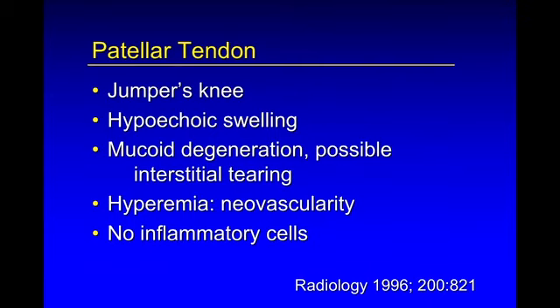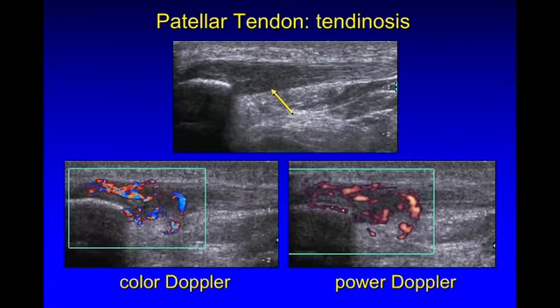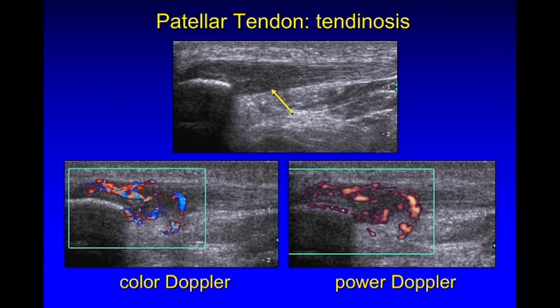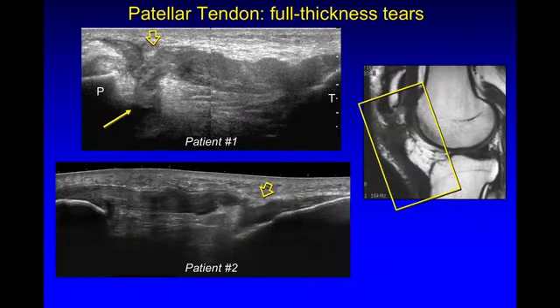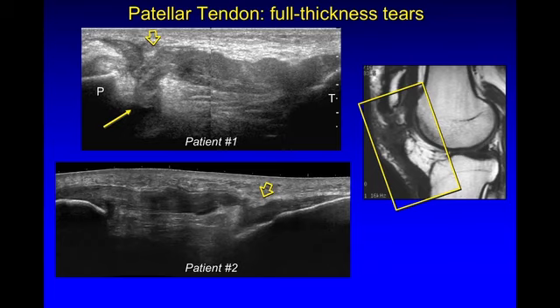Moving on to the patellar tendon, looking at what's called jumper's knee — tendinosis and possible interstitial tearing of the patellar tendon, usually proximal, typically central and deep. Neovascularity is often present, again representing hyperemia and not inflammation, and this corresponds to patient symptoms. Here's the normal patellar tendon, fibrillar and echogenic, and here we see hypoechoic thickening and hyperemia, consistent with tendinosis. Here are two companion cases showing full thickness tears of the patellar tendon — a defect at the proximal part and a defect of the distal tendon — with complete discontinuity and retraction indicating full thickness tear.